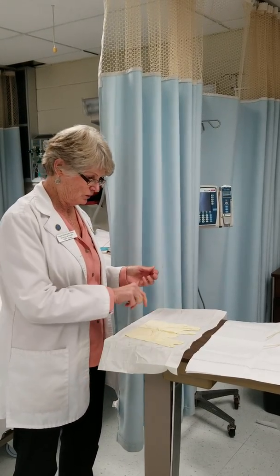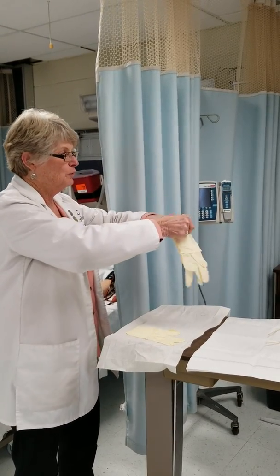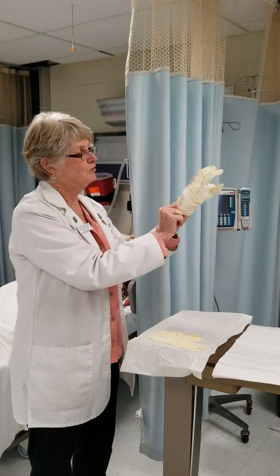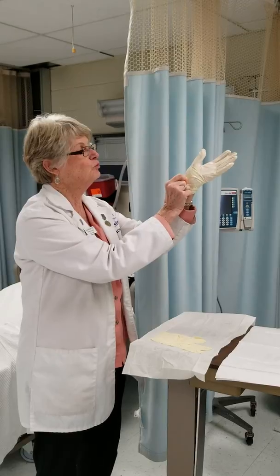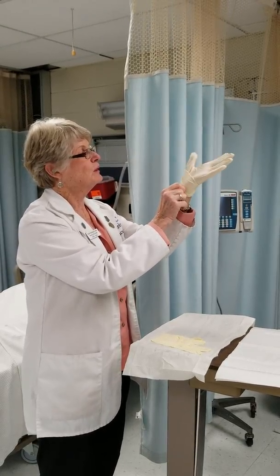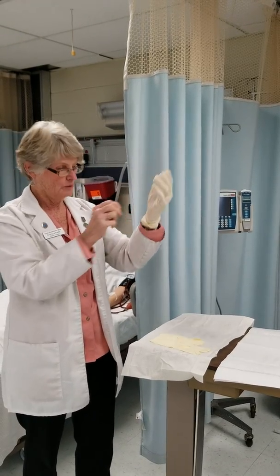Okay, so I'm dominant left hand, so I'll go with my left hand first. Lift it up off the package. This is the side that will be turning onto the inside of my skin, so I can grab it because it will not need to be sterile. And pull this down a little bit over there.